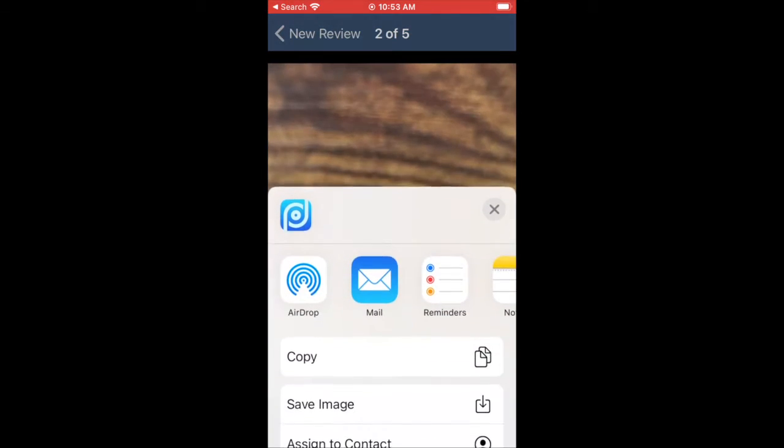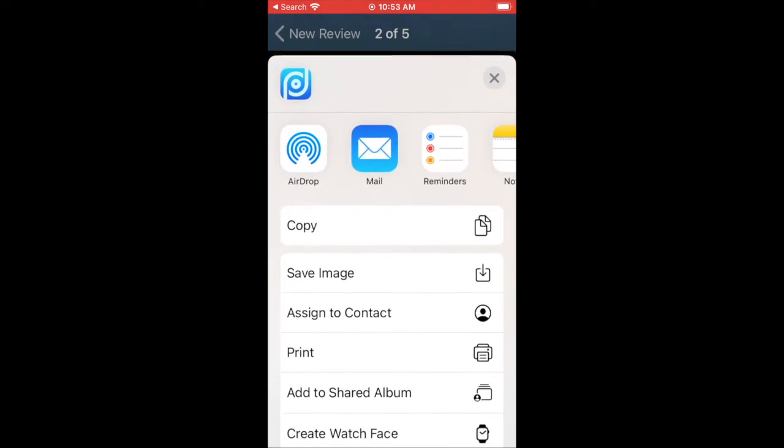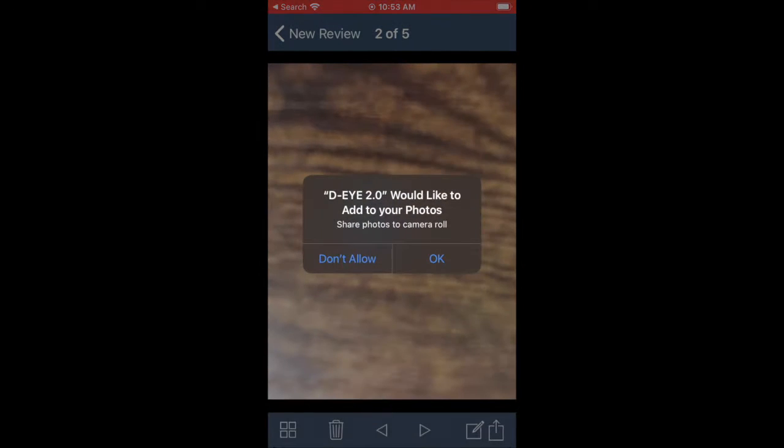Once we're finished, we'll go to the acquisitions, and we'll look at all our different acquisitions. We'll choose the best one, and then we're going to press the share button in the bottom right and save the image to the iPhone. And then after that, you'll have to transfer it to the computer for diagnosis with the app.